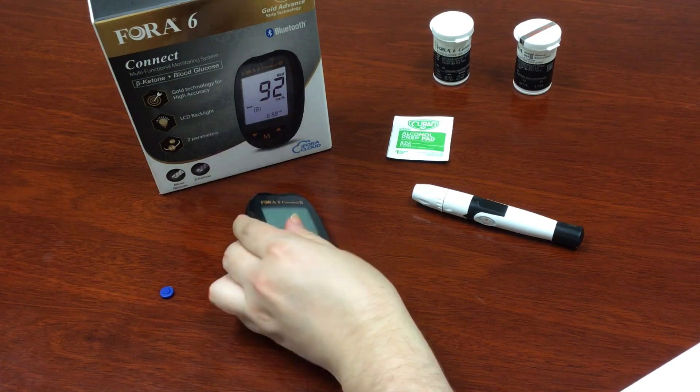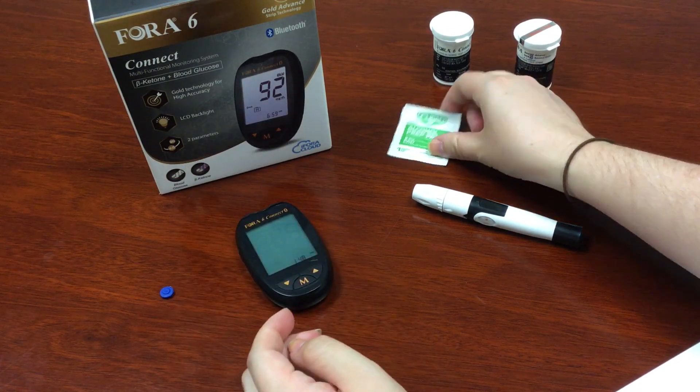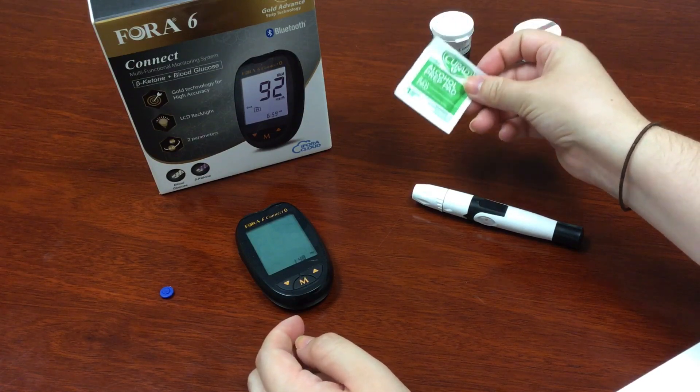Make sure to wash your hands before you begin. You can also use an alcohol swab to clean the testing site if you'd like.